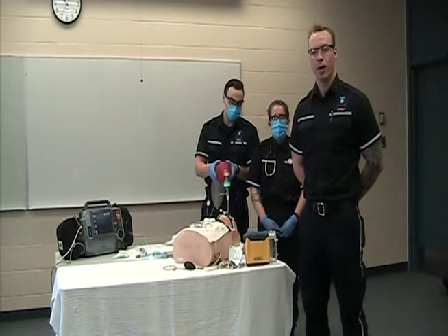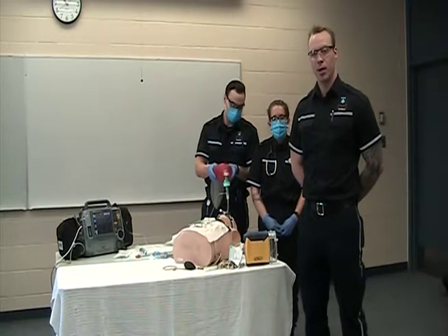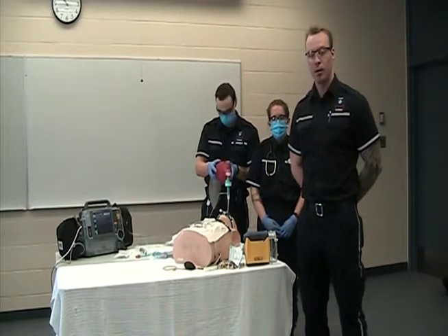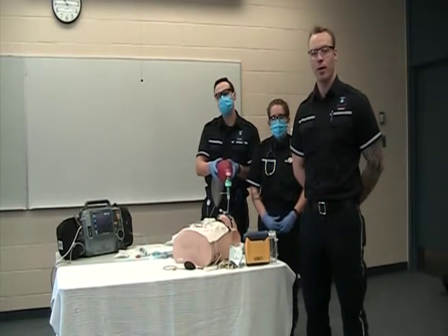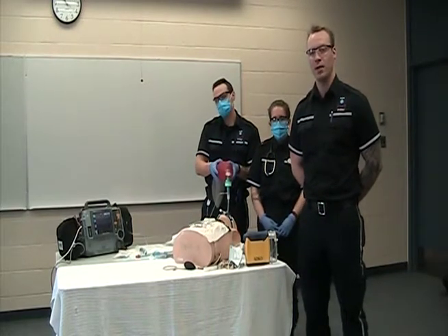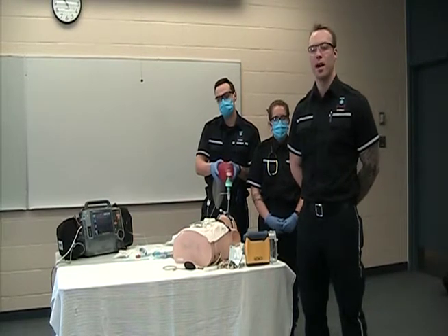P would be pneumothorax, so we may have popped a lung. We can fix that by doing needle decompression. And E, any equipment failure. The end-tidal may have been pulled out of the monitor, the SpO2 may be off the patient's finger. We can fix that by putting all the equipment back into place. And if none of those things are fixed, then we'll have to extubate the patient.